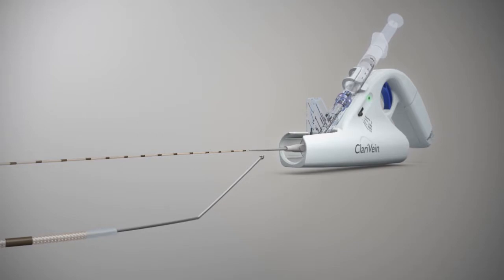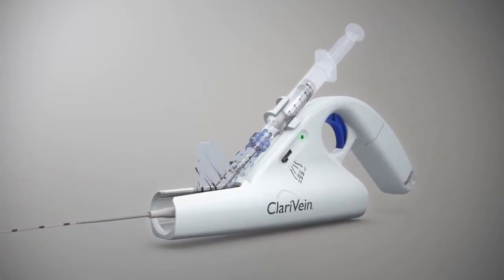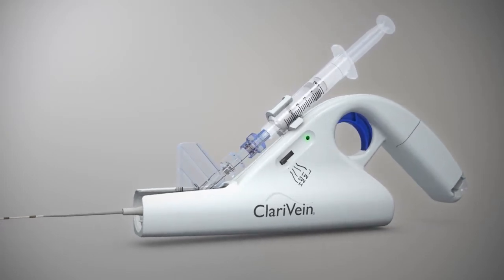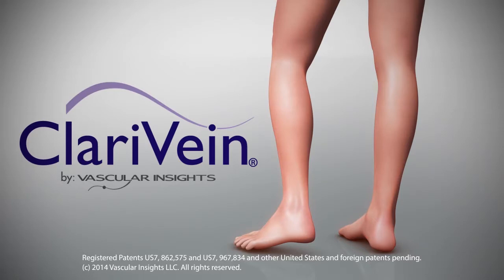Operators of the Clarivane system can feel confident, offering a safe and effective non-thermal treatment, while patients enjoy a virtually pain-free procedure and a fast return to everyday activities.